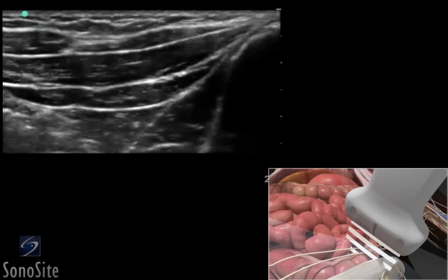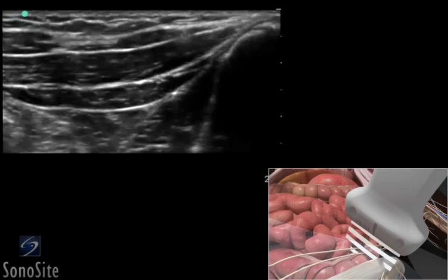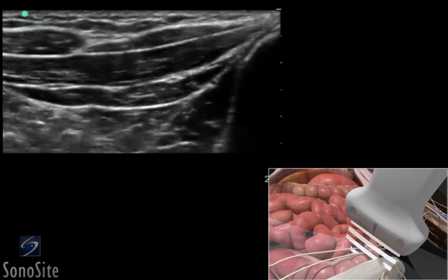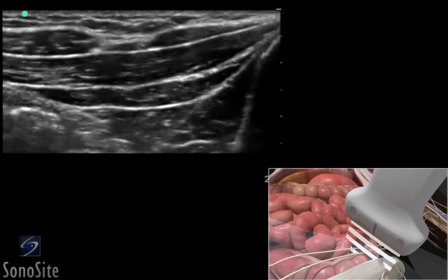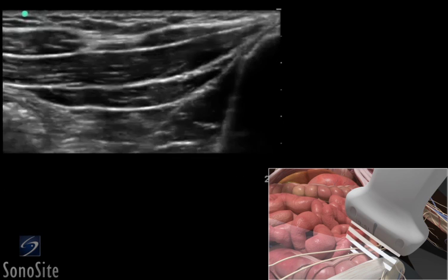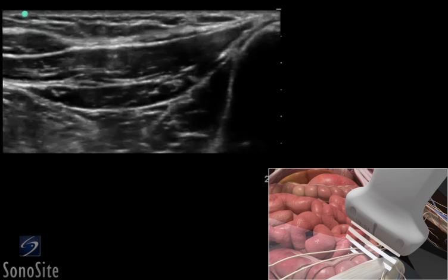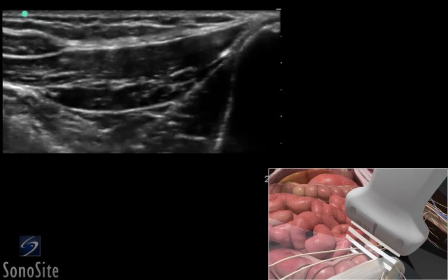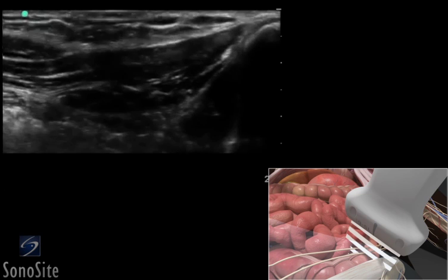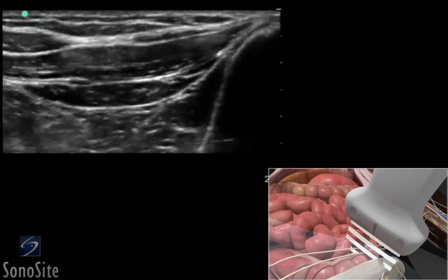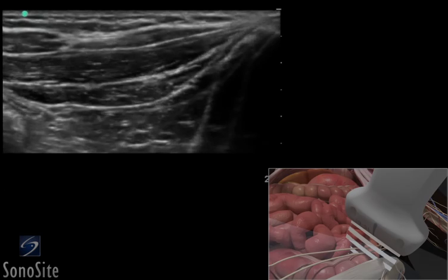A linear array transducer with a nerve exam type is used to perform an ultrasound-guided ilioinguinal and iliohypogastric nerve block. The target depth is approximately 3 centimeters in an 80-kilogram adult.